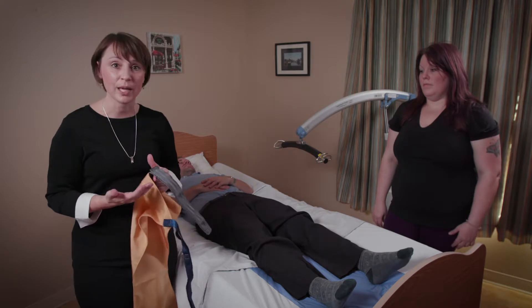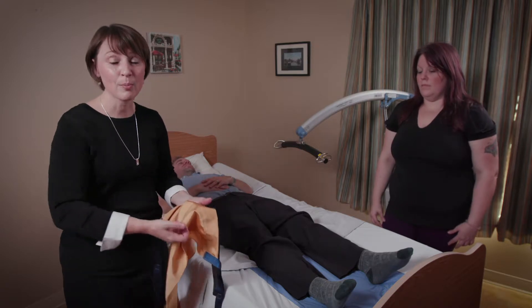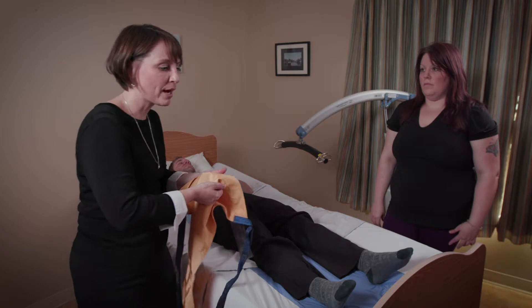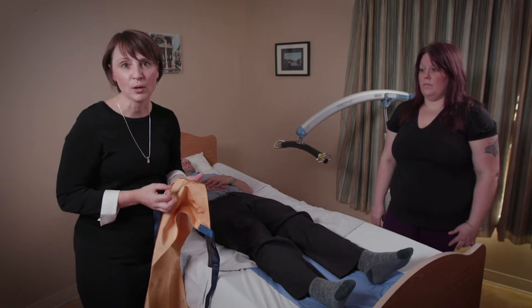So often when you're in home care and health care, we're lifting that leg up to provide some sort of foot care or wound care. We're holding what may be only 35 pounds, but perhaps we're at an awkward angle as we hold onto that leg and we're sustaining that hold. So we want to eliminate that where we can.